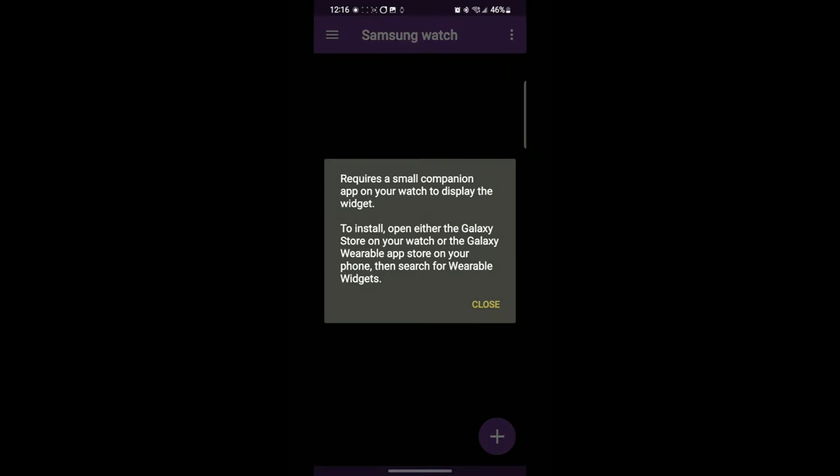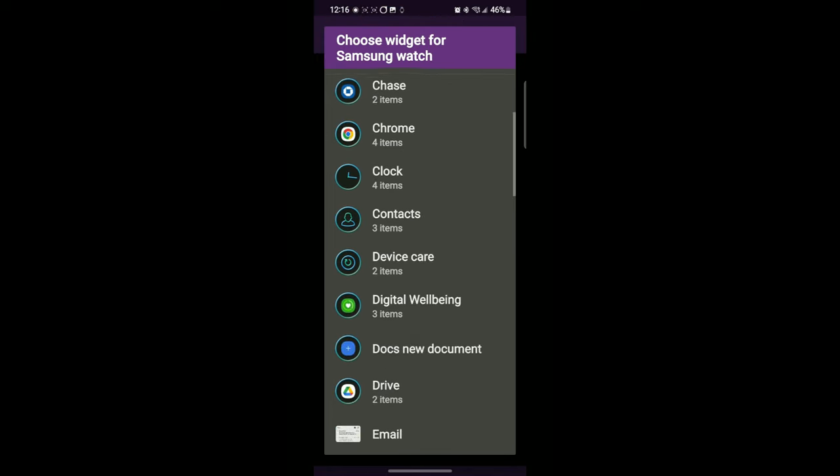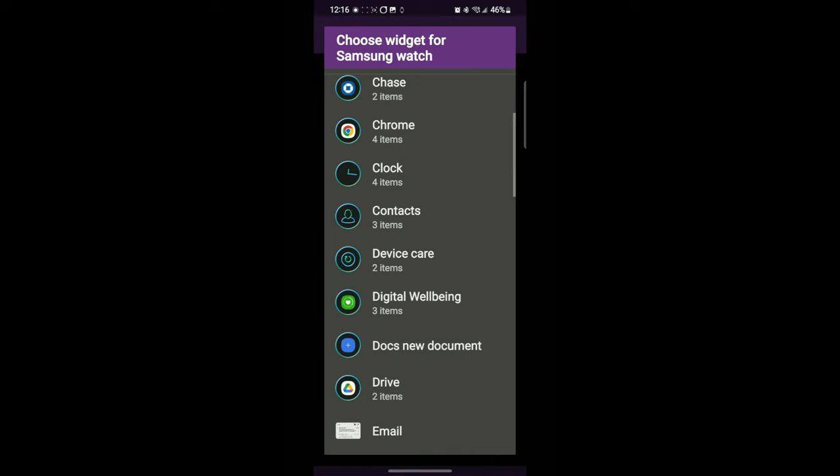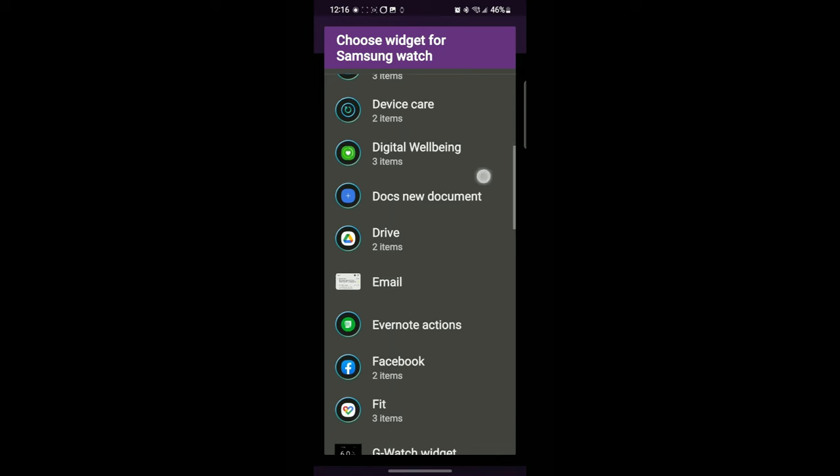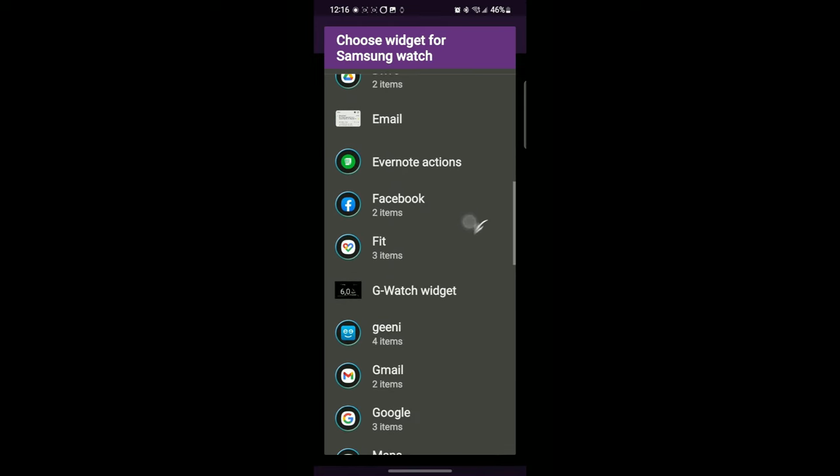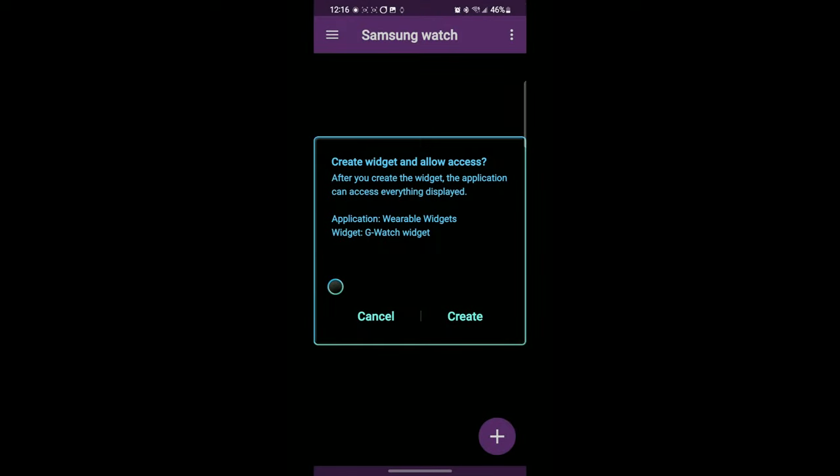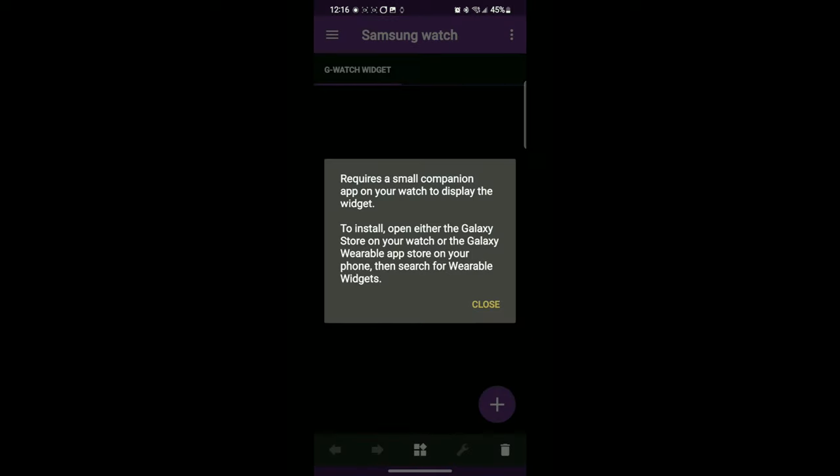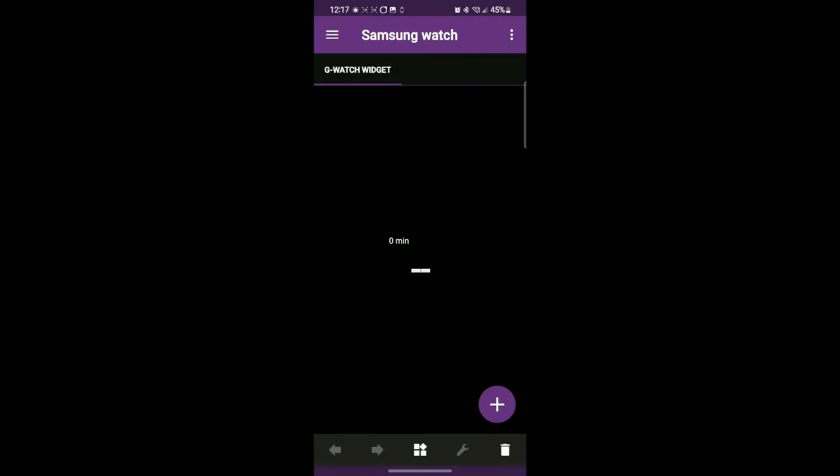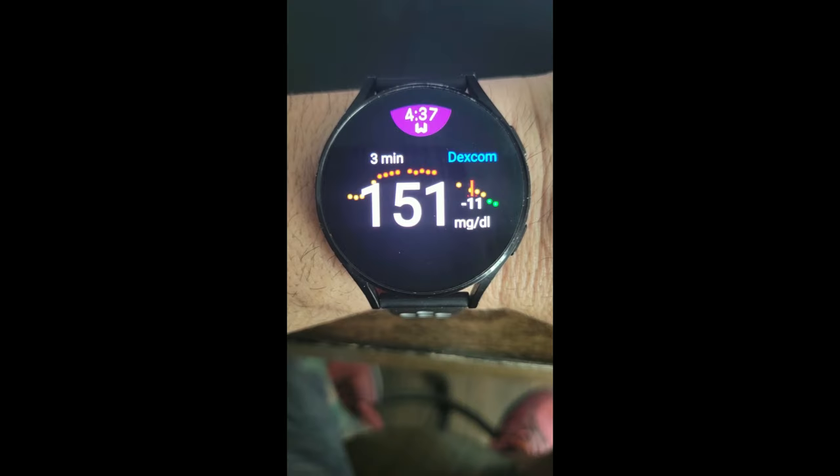It requires a small companion. So it's asking me to choose a widget for a Samsung watch. It's already identifying that. So what I'm looking for is that G Watch widget, that one. Create a widget, allow access. Yep, I think that'll work. Requires a small companion app, you already told me that. And so this is what the widget or the watch face is supposed to look like, but there's nothing there yet, so we have to configure it. Supposed to look like this, but right now it looks like that.